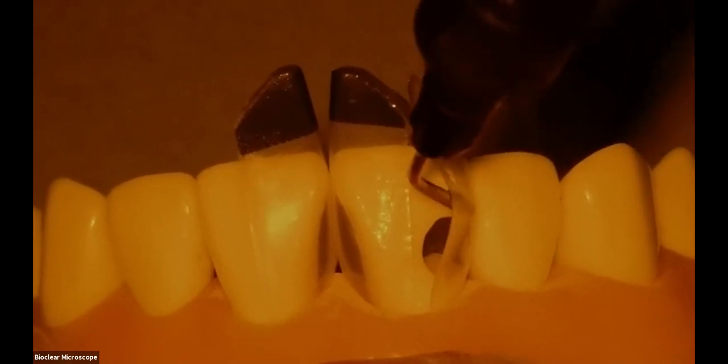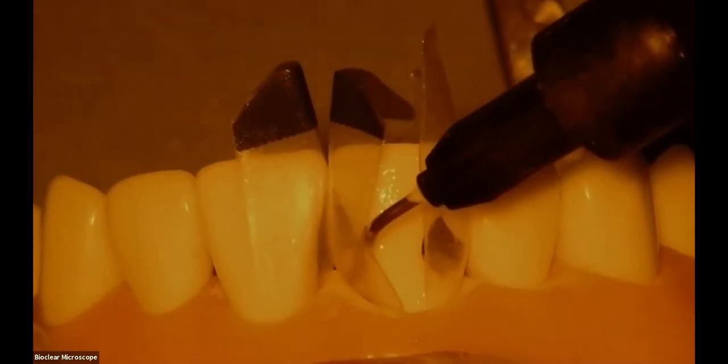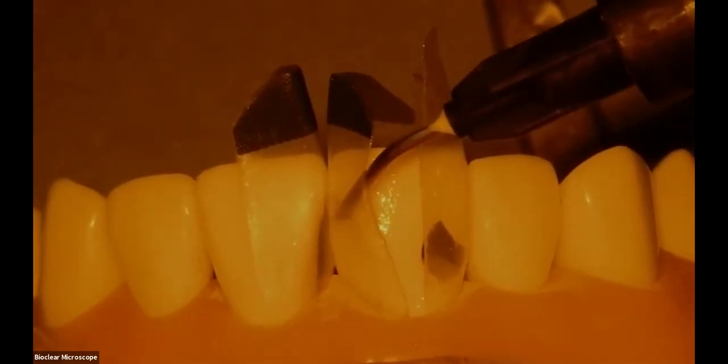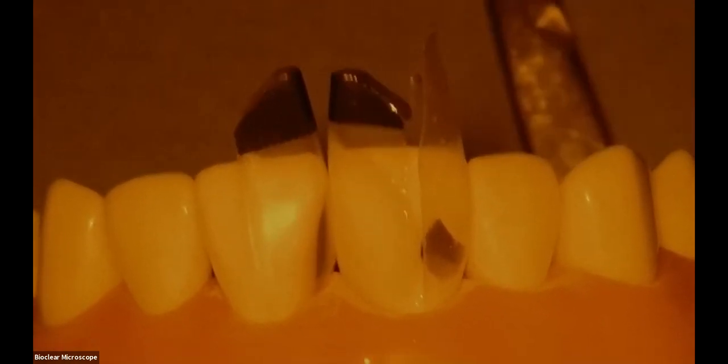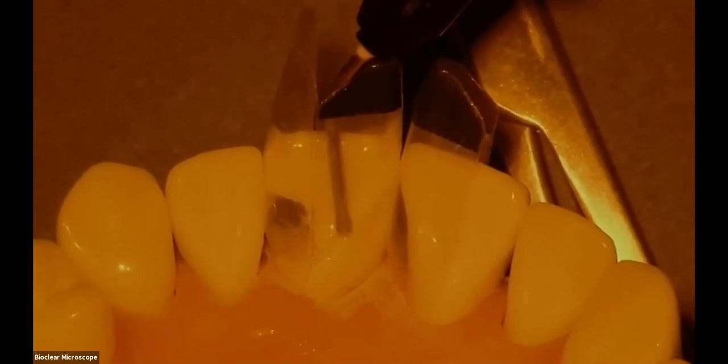And then I'm going to coat the contact here. And then I'll do the mesial, same thing. This is heated flowable composite, and then we coat the contact. And now I'm going to go ahead and marry the flowable composite that was injected from the facial. And we actually fill the lingual in a case like this because we're doing an aesthetic upgrade of the tooth.